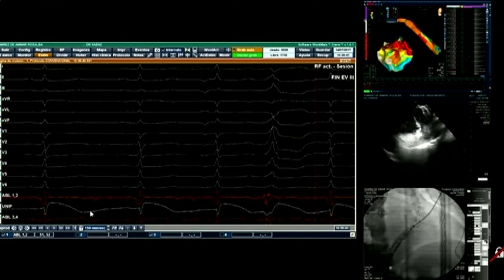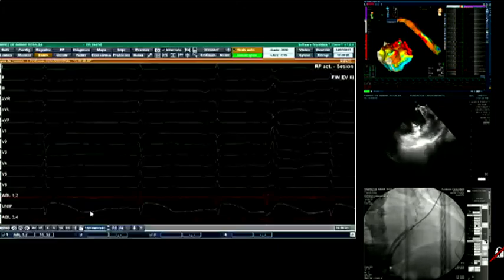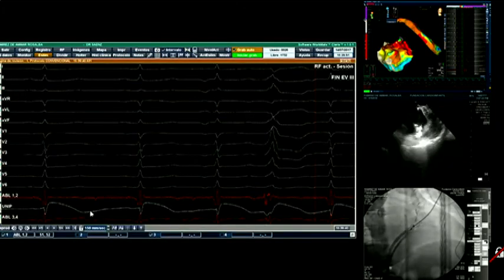The axis from the neck to the coronary sinus being more favorable, yes, I fully agree with you, but necessarily a larger catheter might work the same, but it could perforate the same. Now the favorable curve of the neck could be something better also in this case, but since we started with the venography and we recognized the anatomy from the very beginning, we were prepared to not push anything. And when we realized the location and the bracketing, we stopped and we went to the endocardium.